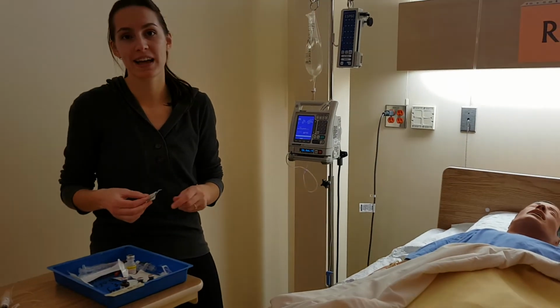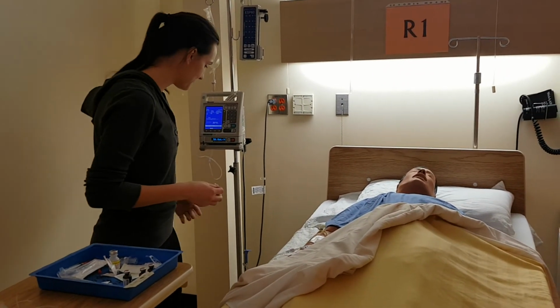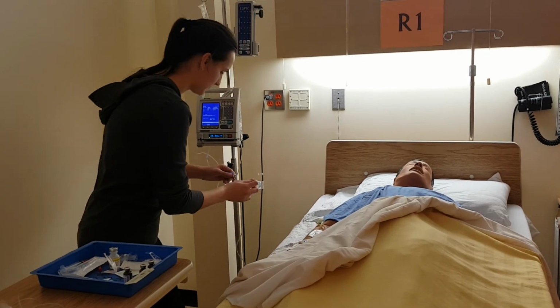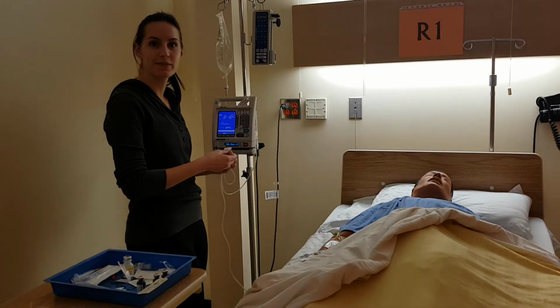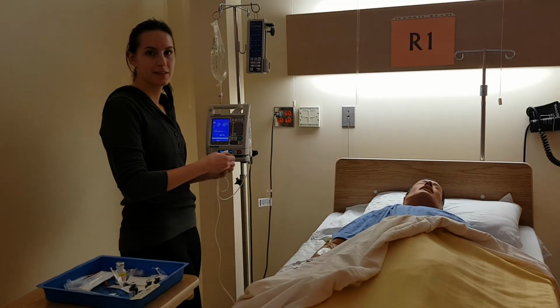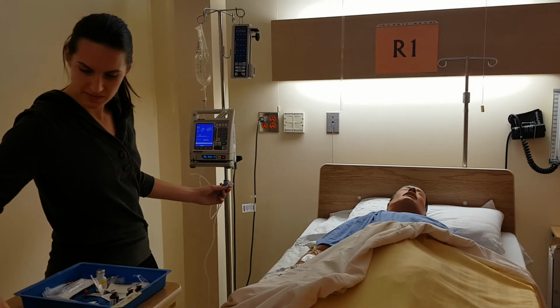I've known that the patient has the right to refuse, but has not done so, so I am proceeding. Patient is in no distress or anything. I'm going to swab this for 30 seconds and let dry for 15. I'm calling out, your student today. Can you tell me your name and your birth date?